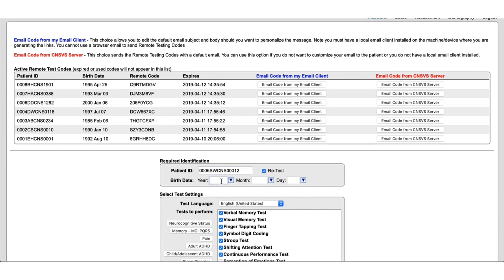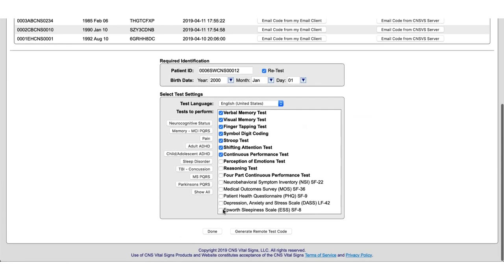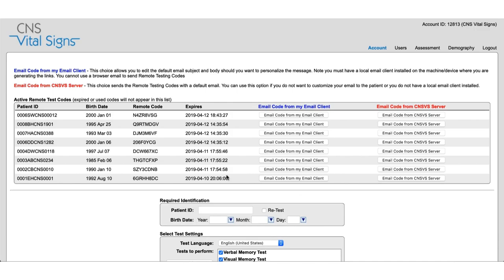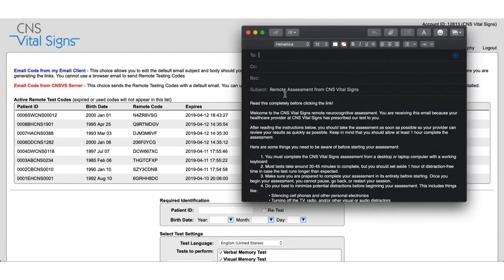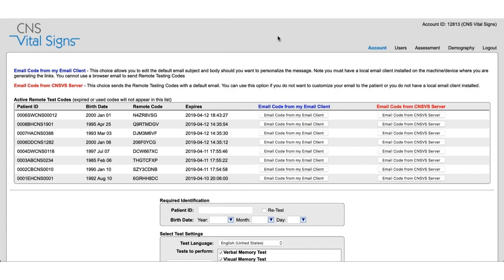Make sure to click the retest button just to confirm that this is someone that does need a retest because they had a computer error or a user error or something along those lines during the test process. Enter their information again generate new remote code and send it again and they will be able to access another version of that test that you created for them.